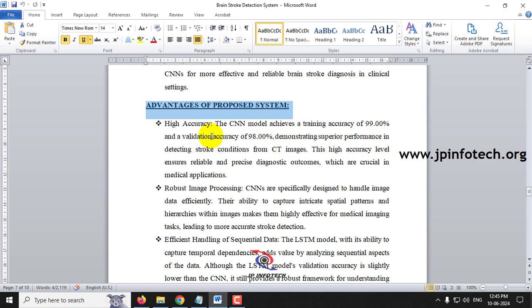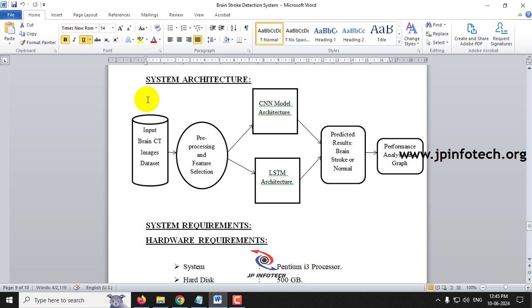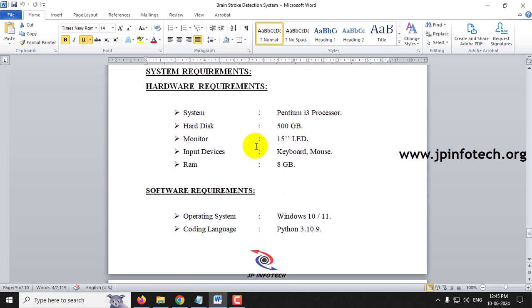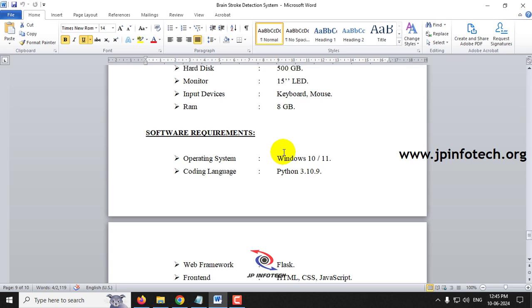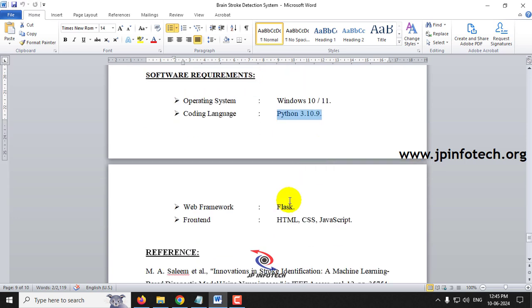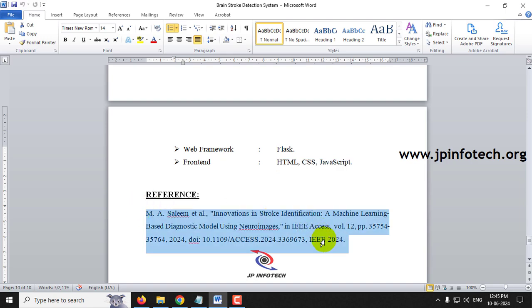The system architecture takes input brain CT images, applies pre-processing and feature selection, and allows selection of either CNN or LSTM model. The predicted result will be brain stroke or normal, followed by a performance analysis graph. The project runs on Windows 10 or 11, uses Python 3.10.9, Flask framework, and an HTML, CSS, and JavaScript front end.